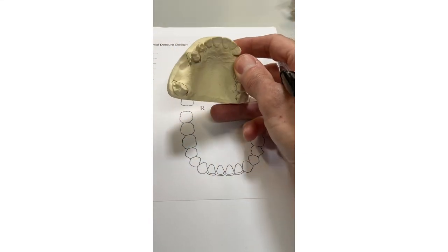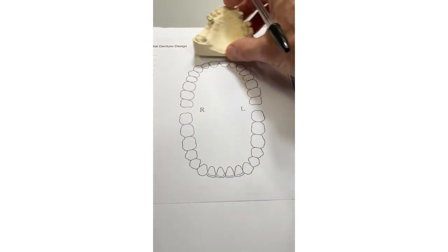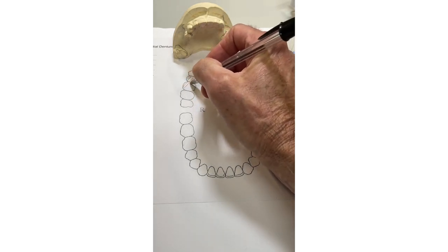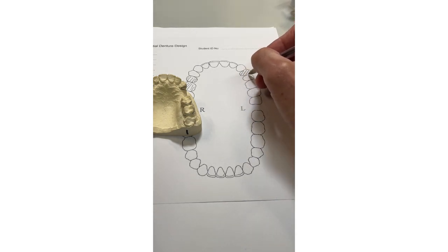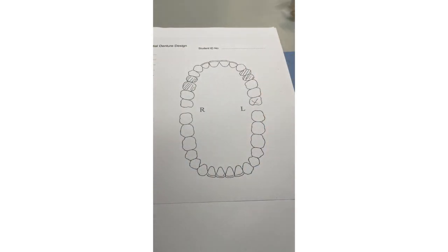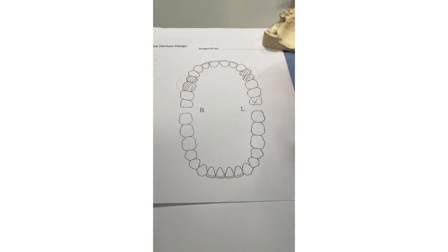This is case number one. From a sketching point of view, you should sketch out the missing teeth by hatching them out. We've got missing five and six on this side, and on the other side missing four and five. If you hatch them out it shows they're missing. If you do a cross on the tooth it implies it's an immediate addition — an extraction. Just hash them out and outline the saddles, drawing a big enough flange to show the technician where the clasp is going to come from.